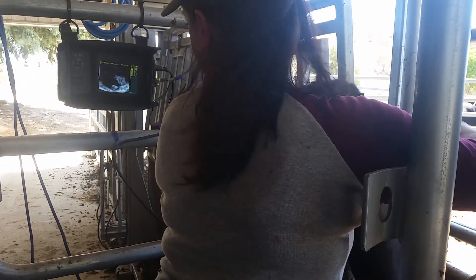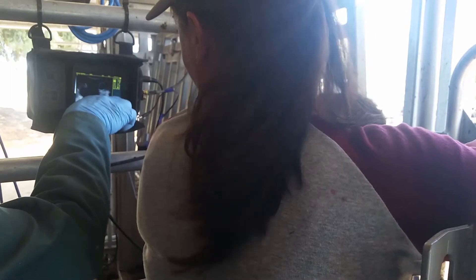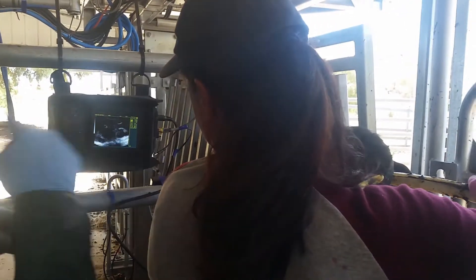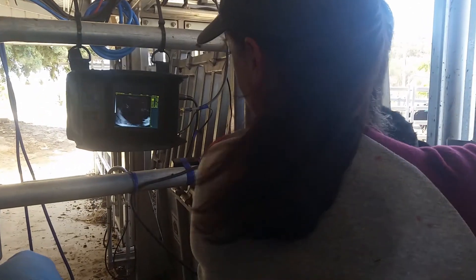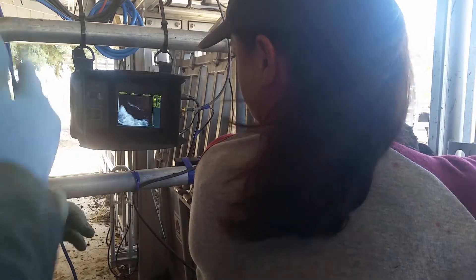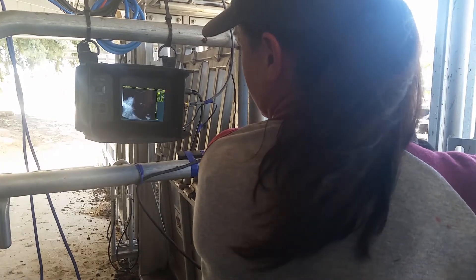If you roll around a bit more, you'll find that that part over there is part of the same calf, but sometimes it's just a flick right round and you could actually pick it up. What you'll find is the calf will be sitting there and then the amniotic fluid is squished right now, which makes it look like two parts.